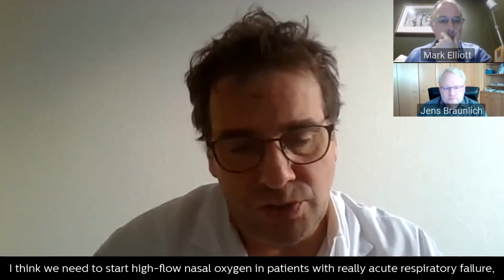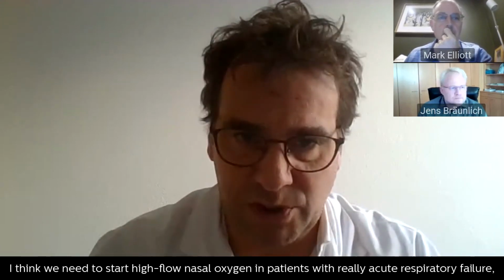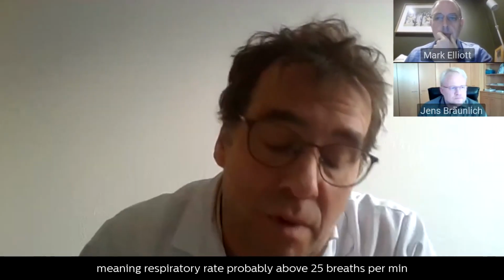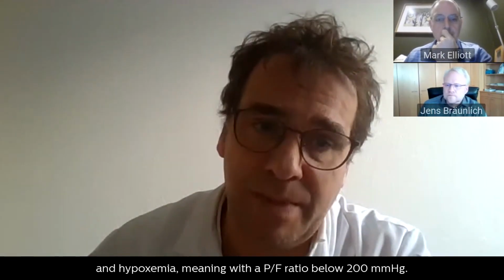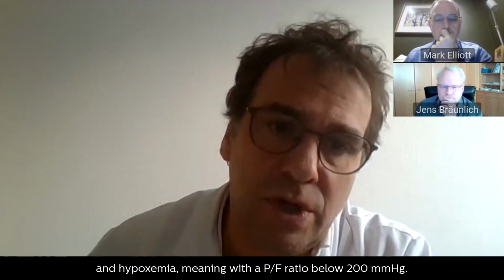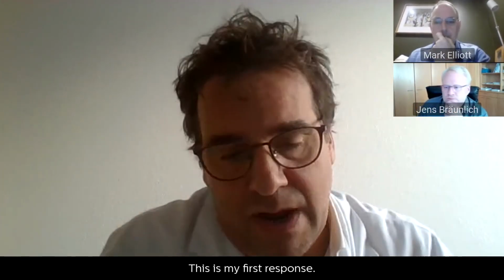I think we need to start high flow nasal oxygen in patients with really acute respiratory failure, meaning respiratory rate probably above 25 breaths per minute, and hypoxemia, meaning a PF ratio below 200 millimeters of mercury. This is my first response.